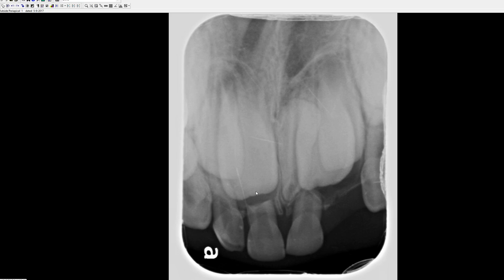Right above that, we have quite a bit of root resorption, as expected. We see the crown of tooth number eight — a big crown. And also, what you should be able to see is the crown of the lateral incisor right there, and you see a portion of the canine as well — the crown of the canine.